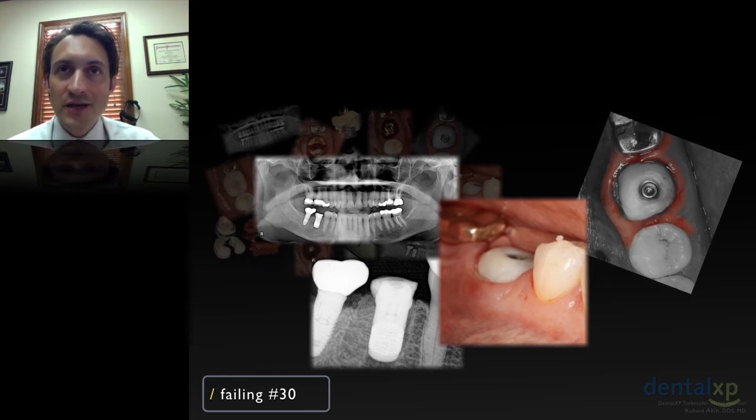Look distal and look at number 31, and look what's happened on the buccal contours of that implant. That is what we see all the time. And when we provisionalize molars, or I'll provide this solution, we increase at least the space for graft material, and we also reduce the changes in the buccal gingival anatomy.